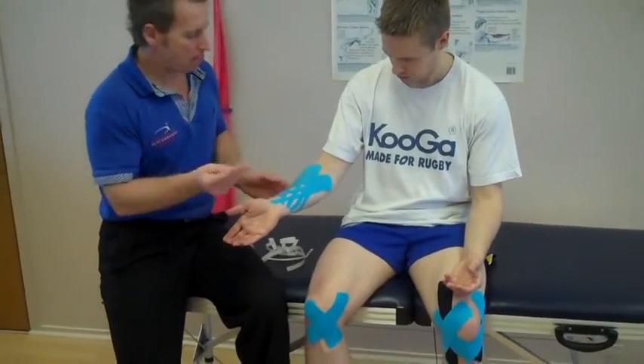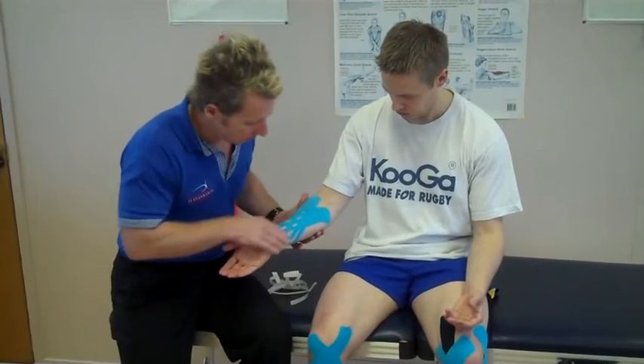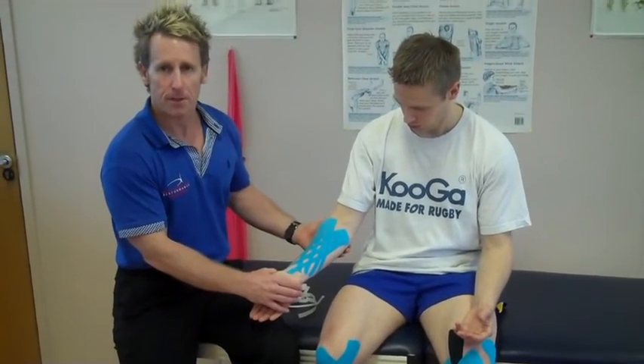Then warm it up — you can use the back of the tape and that just reactivates the actual adhesion, makes it more sticky. You can leave it on for three to five days.